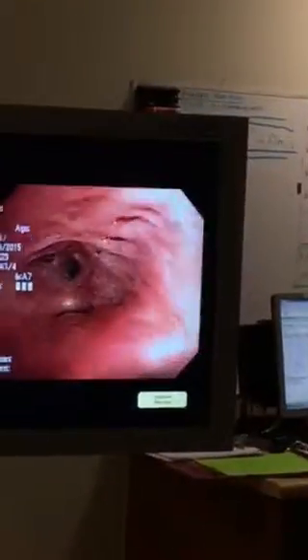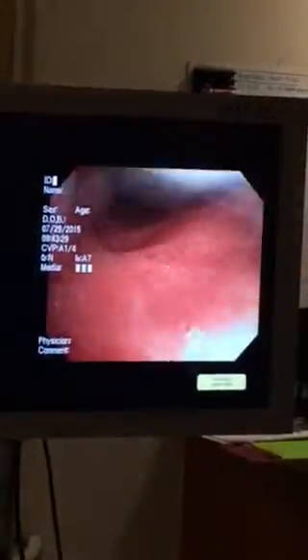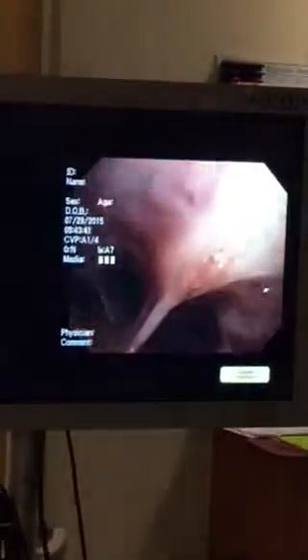That's swollen, and you can see air doesn't get in and out of that middle part of the lung very well. You can barely get in and out of it. I was able to push the scope in there, and there are 2 segments, a medial and a lateral segment. You see those. Medial is about 5 o'clock, lateral is about 10 o'clock.